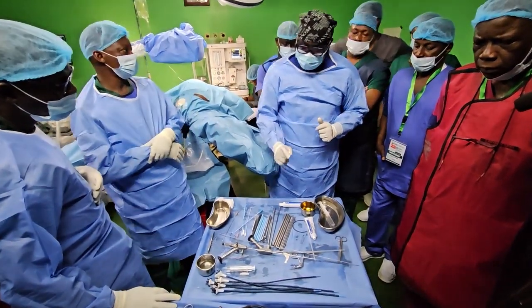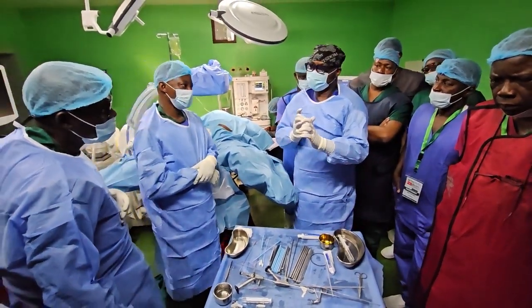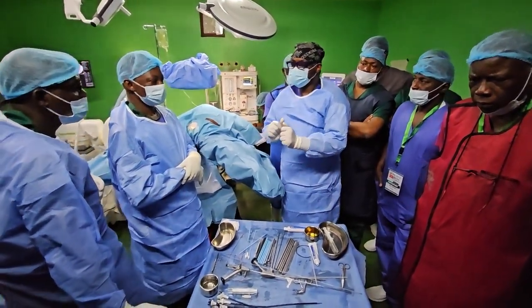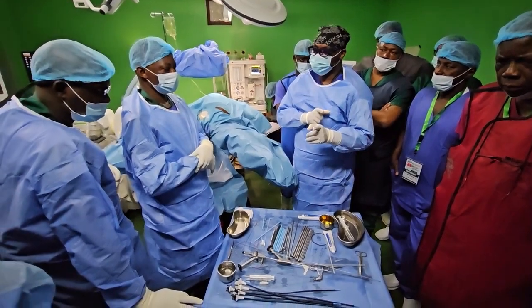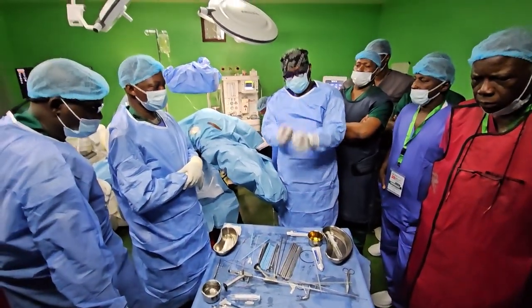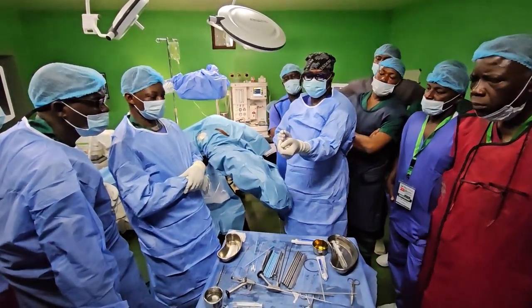But like he said, you must be wary of overdilatation. What he's saying about kidney rupture is overdilatation. Once you are in the calyx, the tip of this rod, you can see it has an indicator.